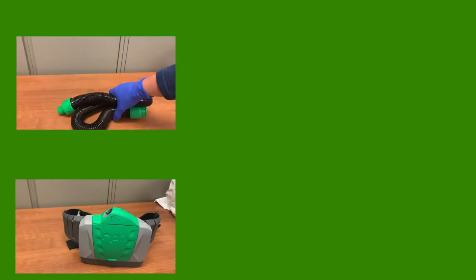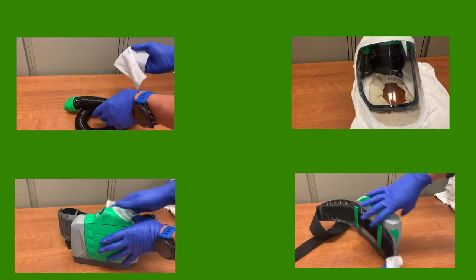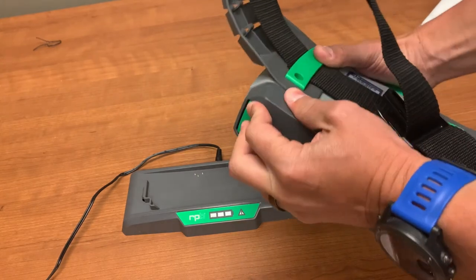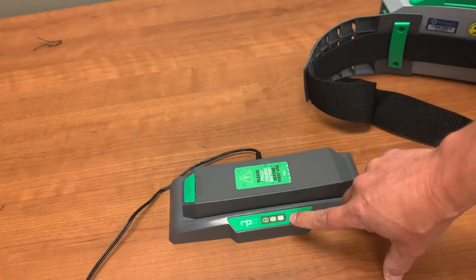After use, the PAPR, hose, and hood need to be cleaned using the gray top wipes. Use multiple wipes to clean the unit, the belt, the hose, and the outside and inside of the hood. Detach the battery from the PAPR and replace it on the charger. When not in use, batteries should always be left on the charger.